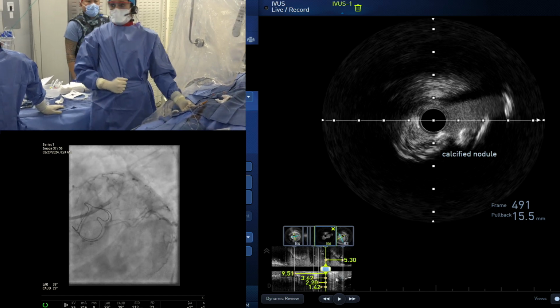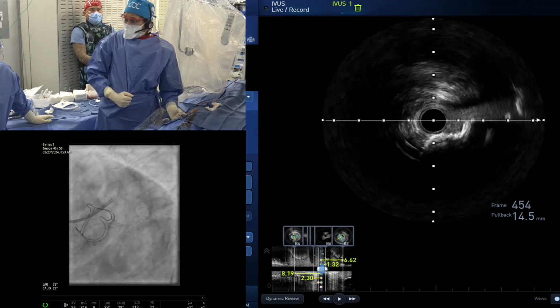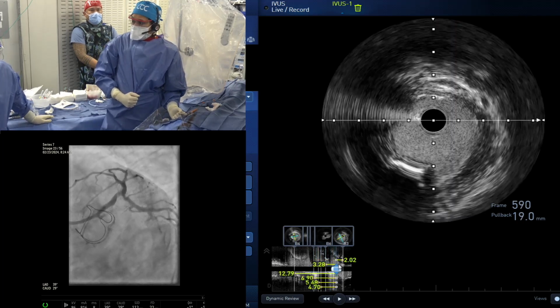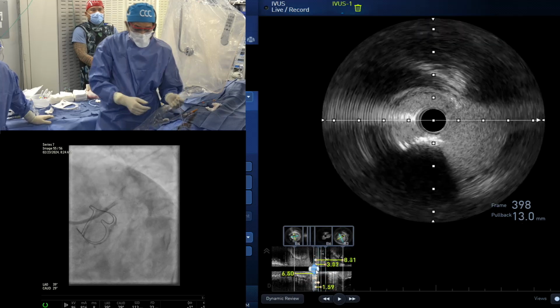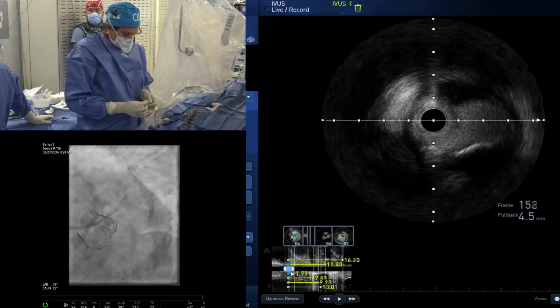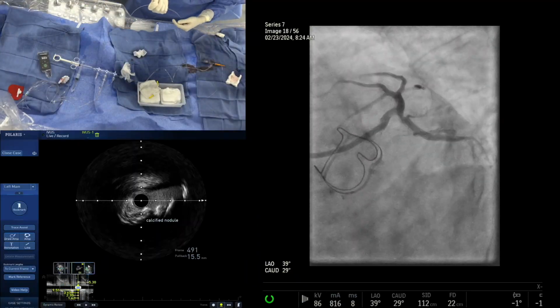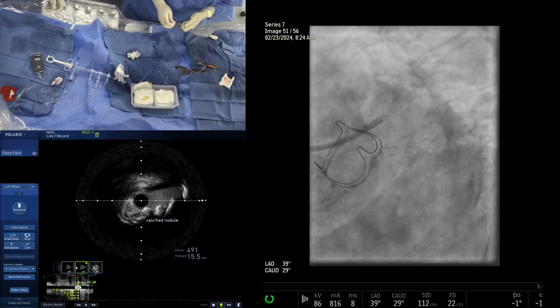Go back to the angiogram. Yeah. No way that you want to do a bigger size burr in this 90 degree angle. As a first one, yes. Or even a second one. So that's the point we are trying to teach. Yes. The bigger size burr we were talking about going from left main to LAD, not into the circ. Right. Agree. Good. As long as this point is clear to everyone.